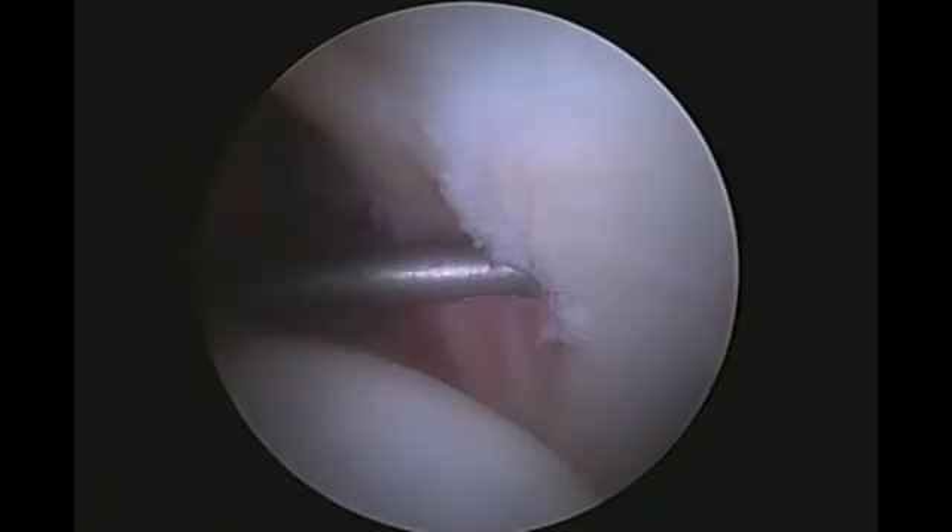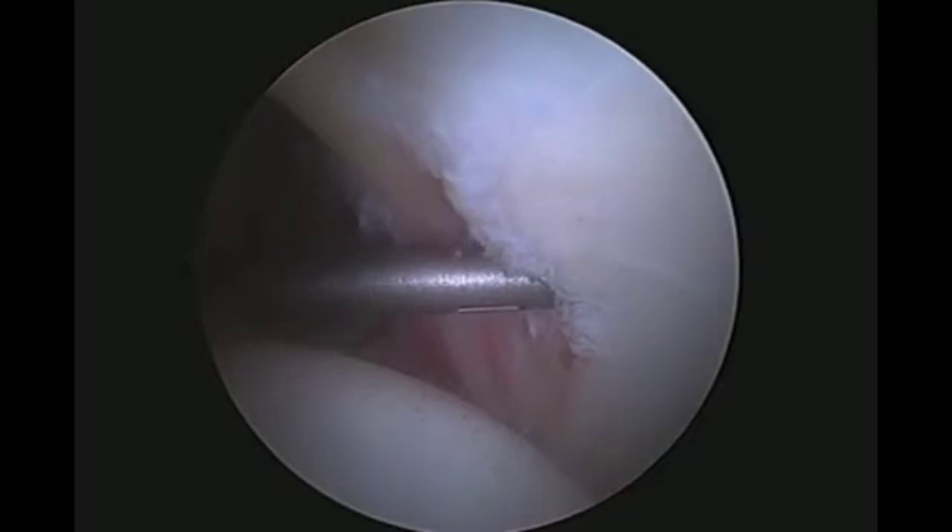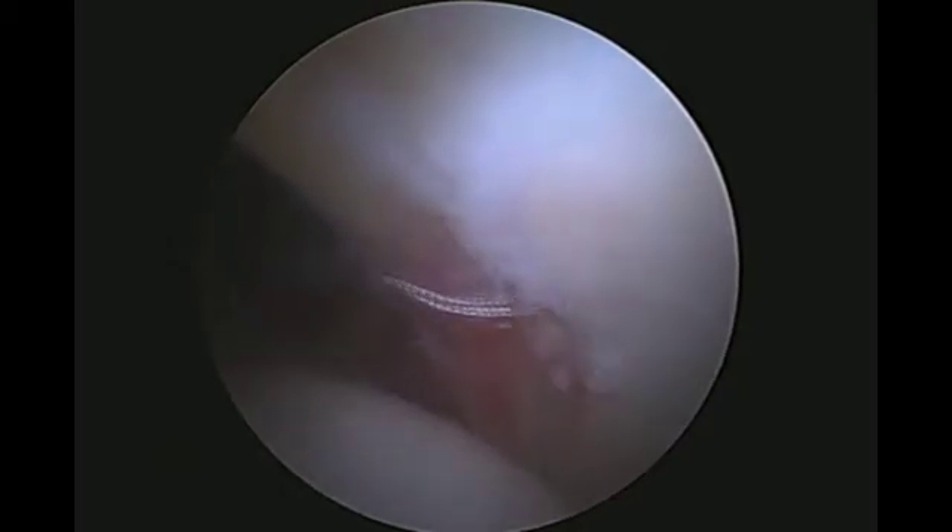Since the tear is anterior, the curvature of the acetabulum precludes placing the anchor peripherally. The anchor trocar is then placed centrally, with the labrum peripheral to it. This position is similar to the angle of anchor placement for a Bankart repair of the shoulder.